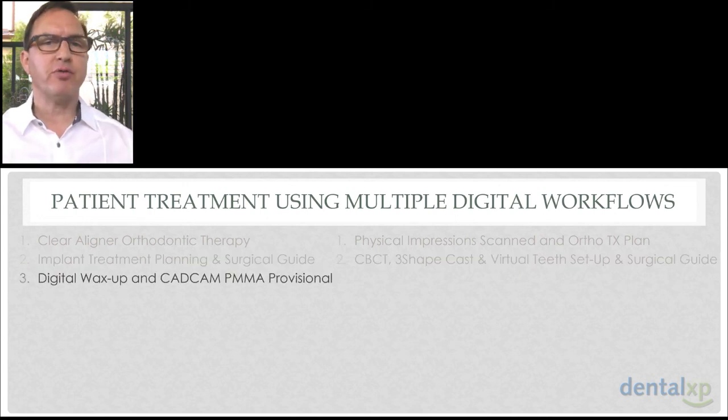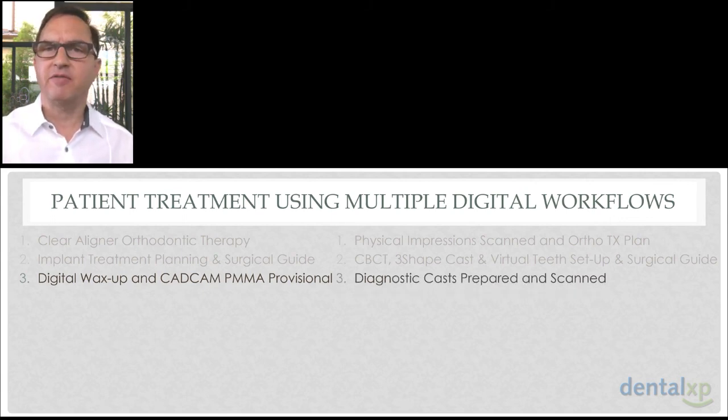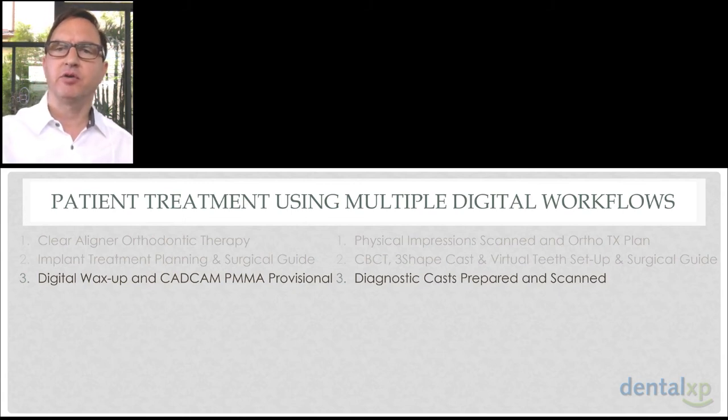Following the completion of ortho, we'd like to order a CAD/CAM provisional, and we'd also like to do a digital diagnostic wax set. How are we going to do that? Well, at the completion of ortho, we're going to take physical impressions, and we're going to prepare and set virtual teeth. We're going to scan those impressions, set virtual teeth, and order a provisional.